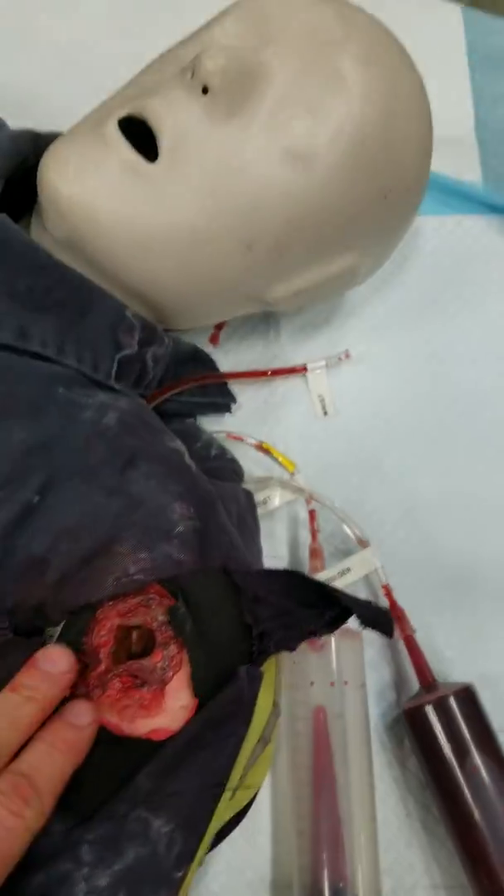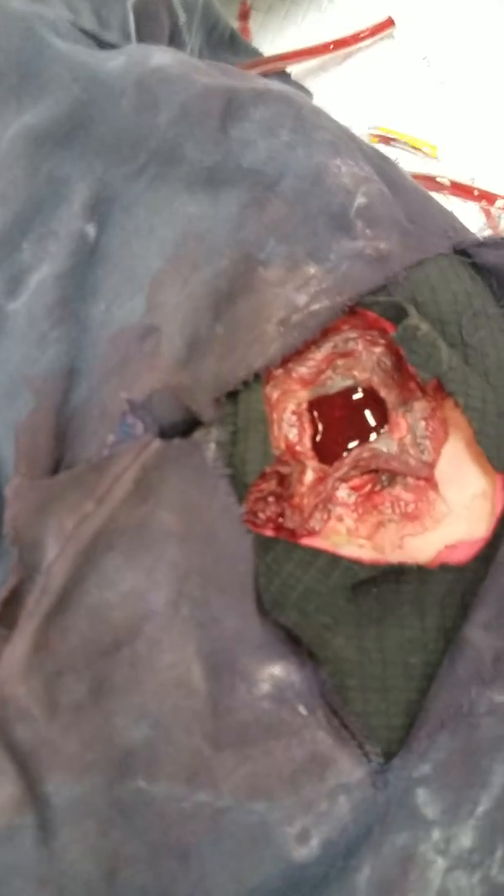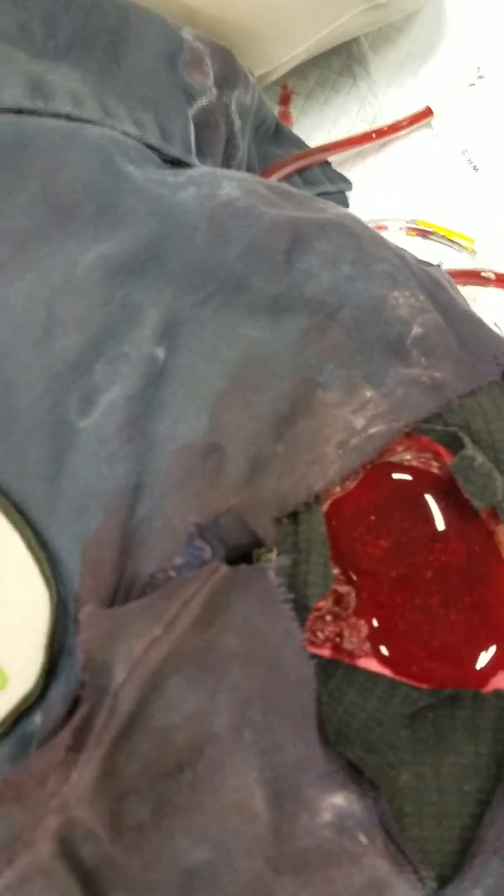Next, we want to have arterial bleeding in a junctional site in the body. Now this would be a place where you couldn't place any tourniquets, but we still have to control bleeding because there are still major arteries running around in these portions of the body. So let's go ahead and turn on the waterworks for this. We have arterial bleeding at a junctional site.